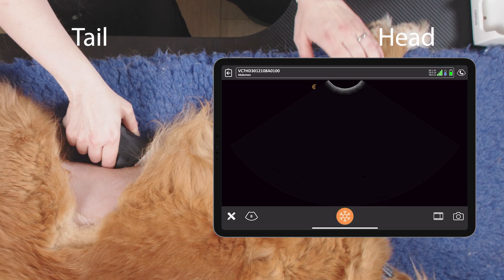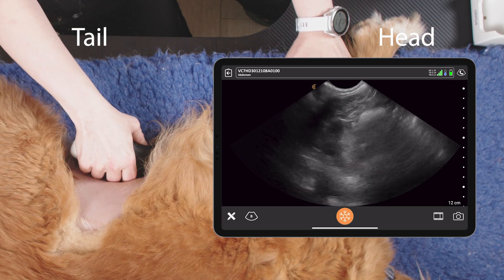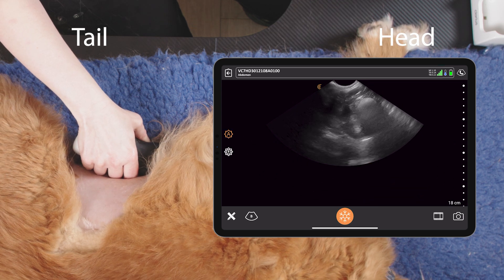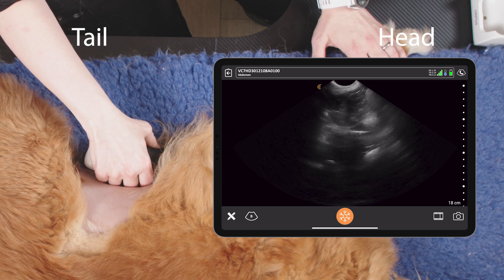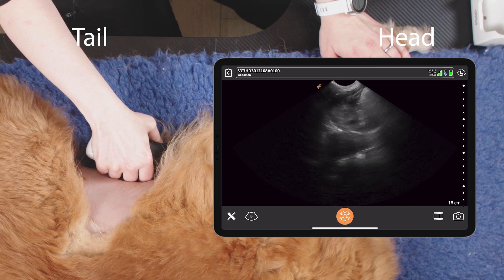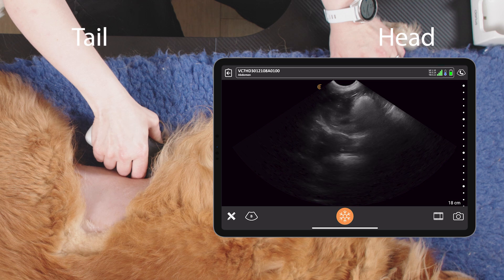First of all, take our probe and place it behind the xiphoid sternum, and we'll be looking deep through the liver. This is our diaphragmatico-hepatic view, and we want to extend the depth as far as possible so that we can see the heart beating or into the thoracic cavity also. And we want to rock the probe and fan the probe.